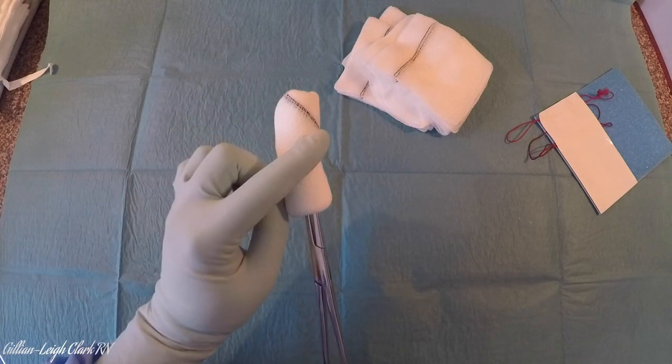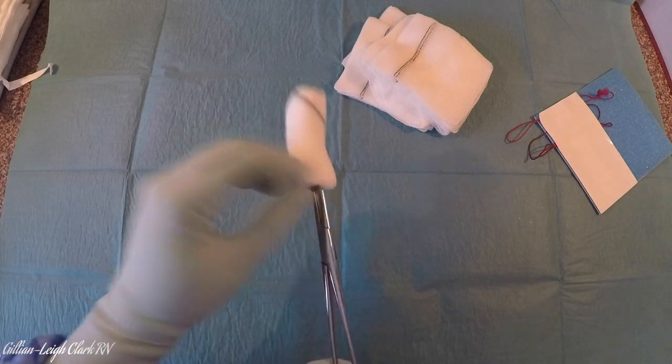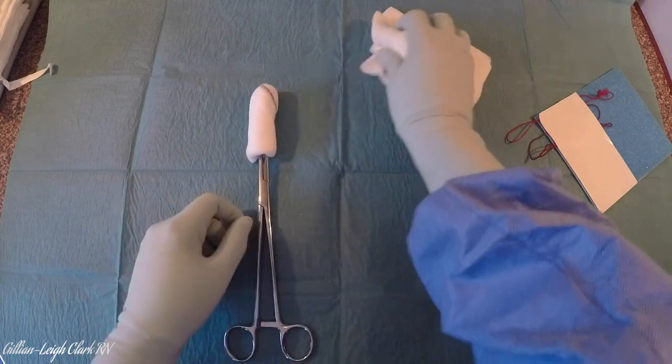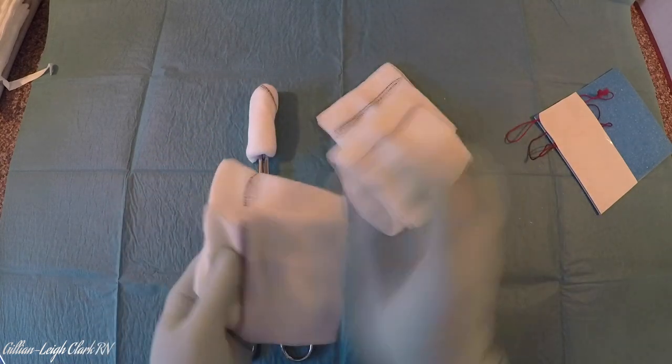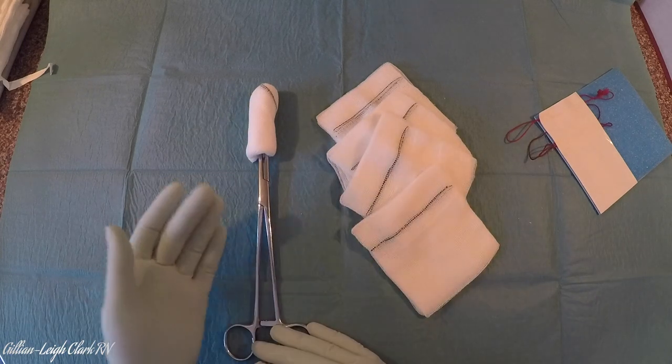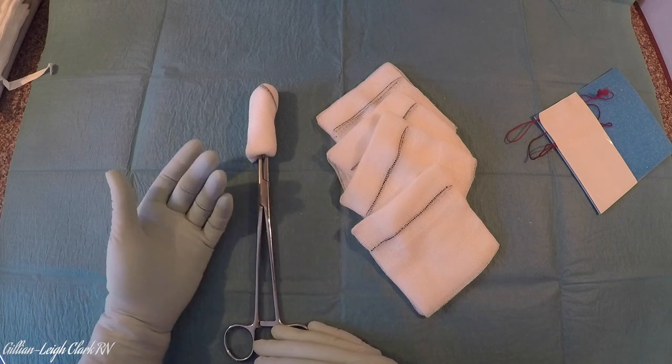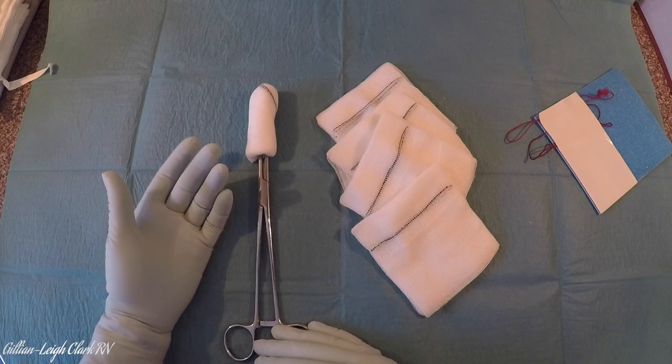Here we have the x-ray strip again on the front. A nice tight swab, which can be used for dabbing. And again, when it comes to your check: one, two, three, four and five. This means that if at the start of the case you needed to mount two swabs on the sticks, it's very easy to account for all your swabs during the case.